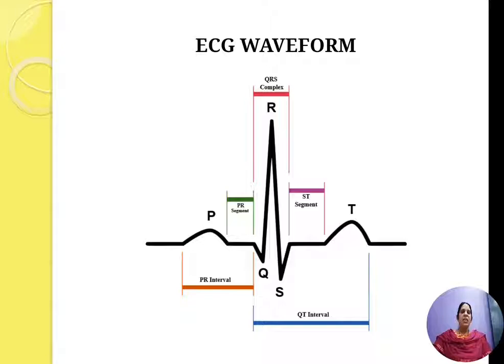During the ST interval, ventricular contraction takes place. It is represented as the ST segment in the figure. The PQ interval represents the time during which the excitation wave is delayed in the fibers near the AV node. So this is your ECG waveform.